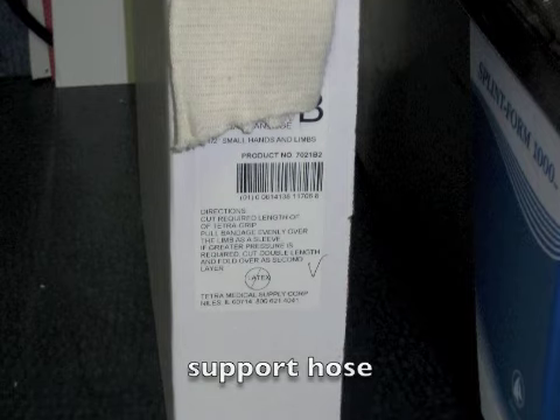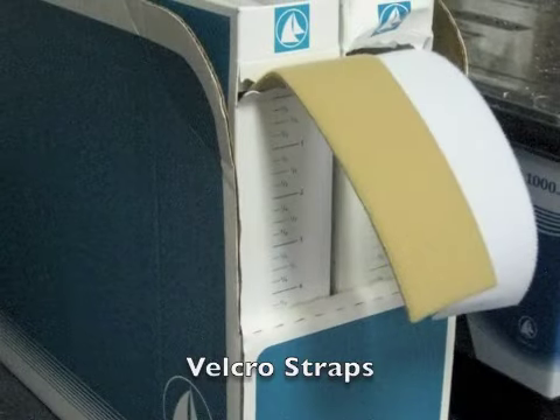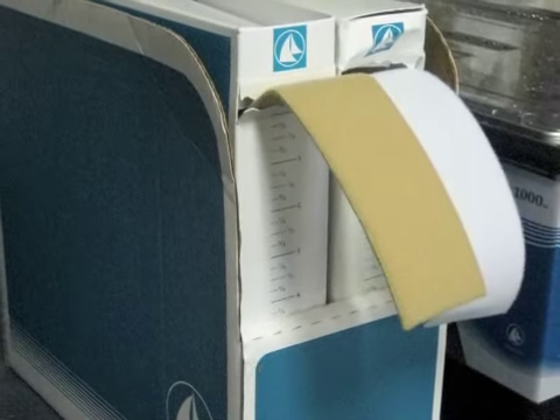Thermoplastic material comes in large sheets, and the appropriate amount of material is cut from the sheet for each splint. Support hose or stocking is used to keep the thermoplastic material from sticking to the client's hand. Velcro straps are used to secure the splint on the client.